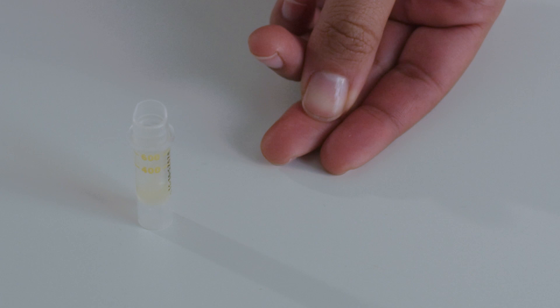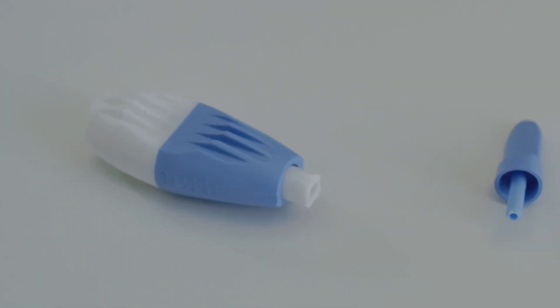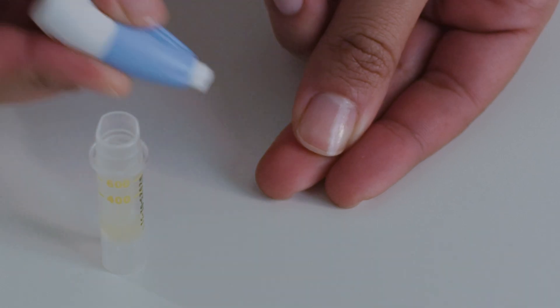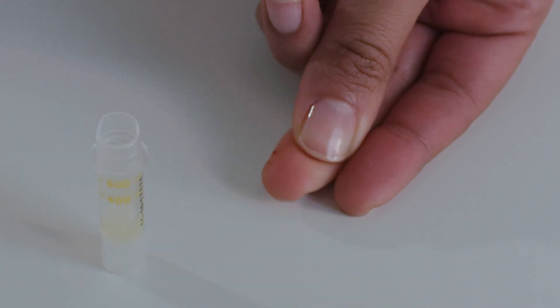Press the top of your finger with your thumb so that the tip of your finger turns pink. With your thumb still in place, press the lancet firmly into the side of your fingertip where the skin is softer and push hard. You will feel a tiny prick.